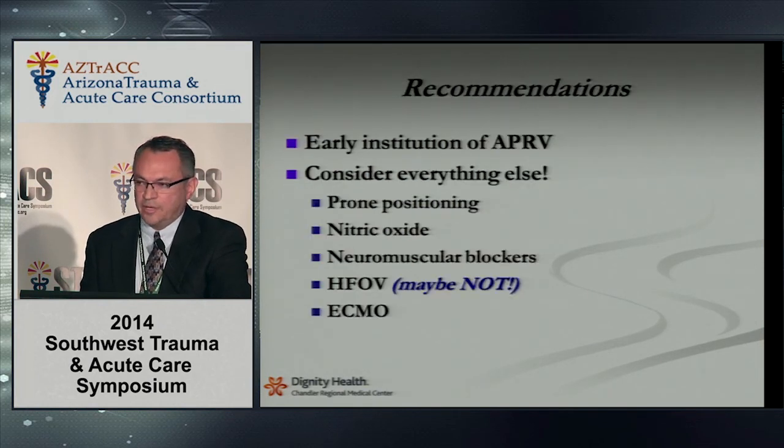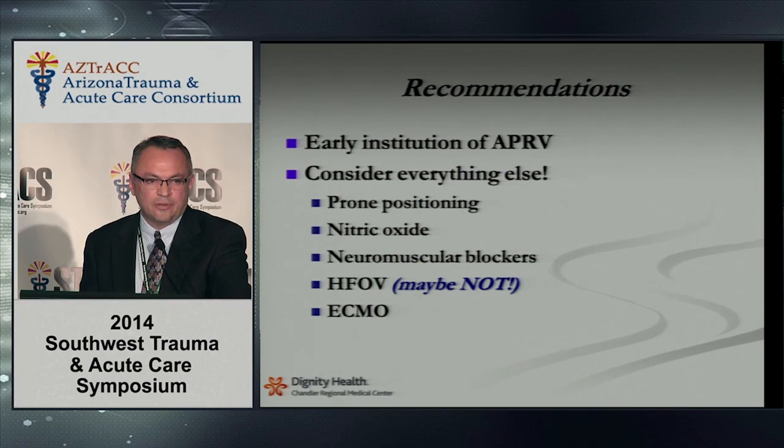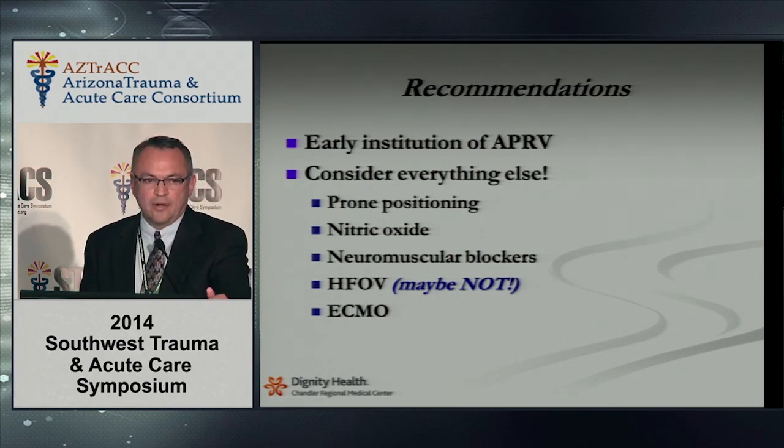Anyway, some of my recommendations borne out by the literature: if you're going to use APRV, bilevel, BiVent, do it earlier rather than later. Everything else you kind of have to consider. If you're going to do it, try and do it sooner rather than later, whether it's a prone position, open abdomen or no open abdomen. Using nitric oxide, neuromuscular blockers, 48 hours at the most. Maybe not consider the oscillator, although it depends whether you buy into those two pretty well done studies. And then certainly ECMO, even though it's last ditch, it's something that you may want to move up higher into your algorithm, because when you get to using these 4 or 5 adjuncts, it may just be too late to transfer the patient to an ECMO center of care.